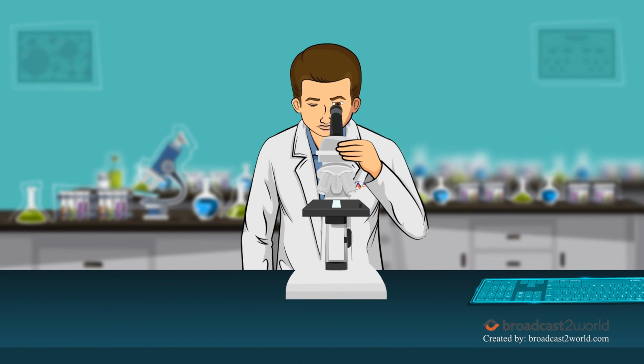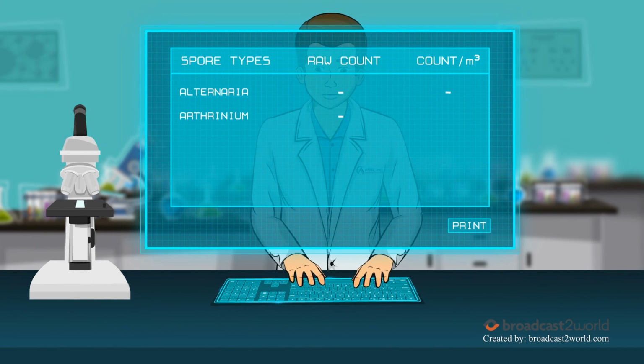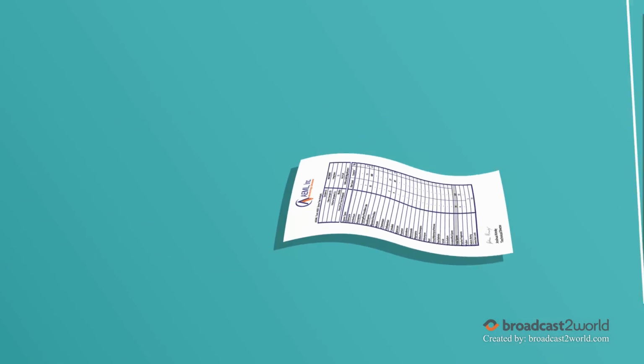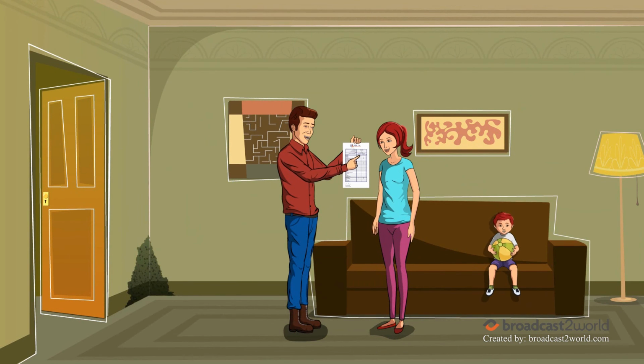Once the lab finishes with the analysis, using the flow rate and time at which the air was drawn into the cassettes, mold present in a cubic meter of air is calculated and a report is generated and sent back to the mold inspector. The mold inspector will in turn explain the results to the client and determine if there are elevated mold conditions at your property.